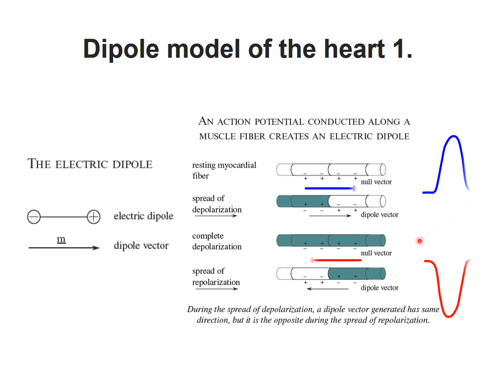The repolarization usually starts where the depolarization started. However, because different charges are present, now the depolarized area is relatively more negative inside and outside. This is why this vector points the opposite way. So during the repolarization, we have a negative deflection.